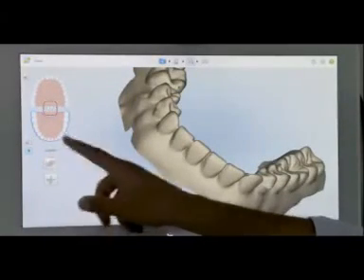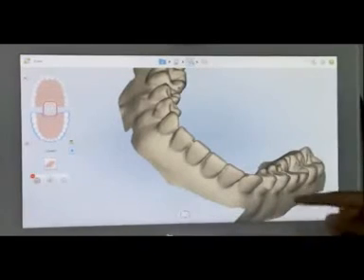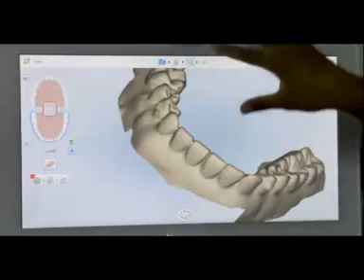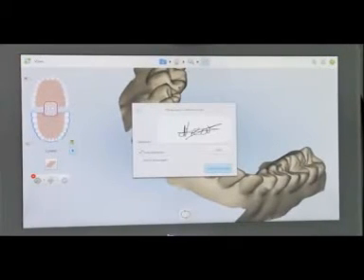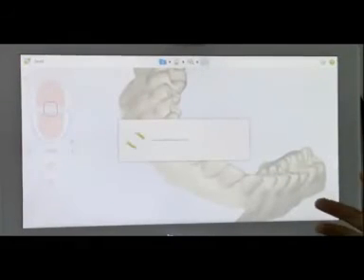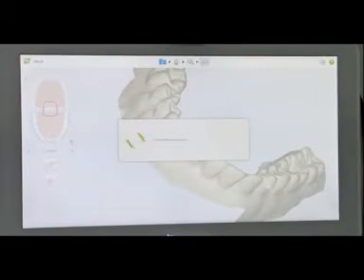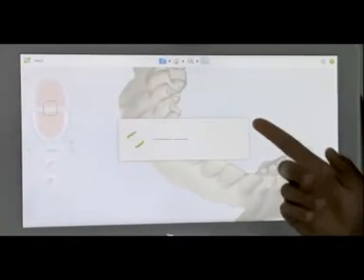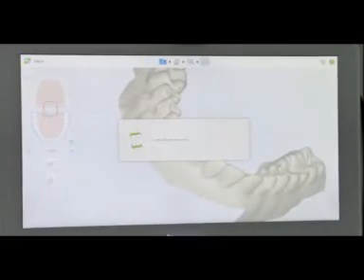And you can erase the whole thing, or you can cut sections of it, and you just press that when you're ready to cut. Then the last thing is you press the email. Once you confirm and send, it doesn't start making Invisalign automatically. It just goes to the cloud, and it sits there until Dr. Nizar fills in his prescription. Exactly. You know that bit because you send people to, but now you can do it all in-house, right?